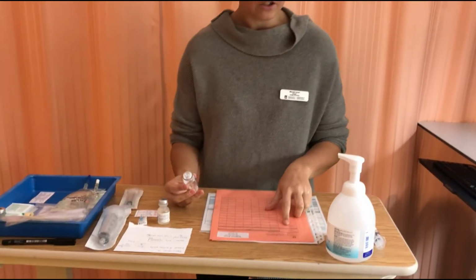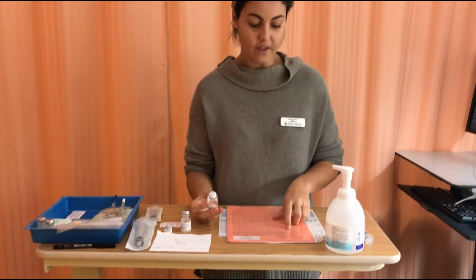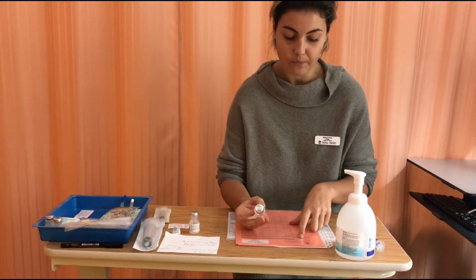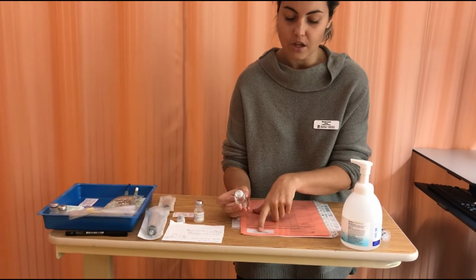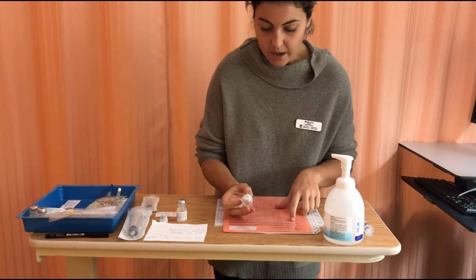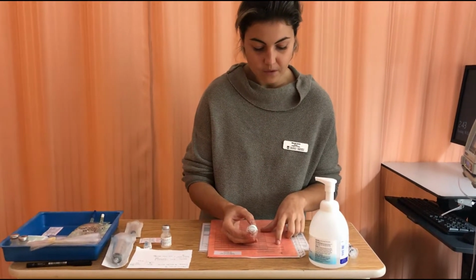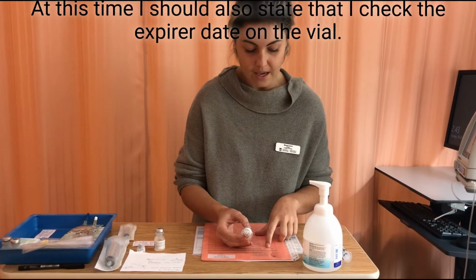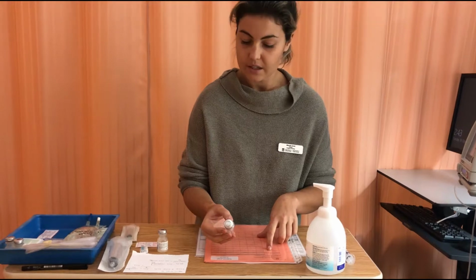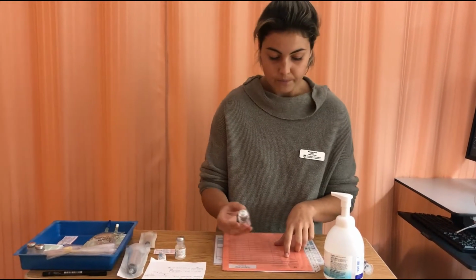The order is penicillin G sodium, 3 million units, IV, every 4 hours in the CIVA pump. So I'm just making sure that I have the right patient. So this is for Emma Wrightson. And then that I have the right drug, penicillin G for injection, so IV, 3 million units. There's 5 million units in here, so that's good. And for right now.